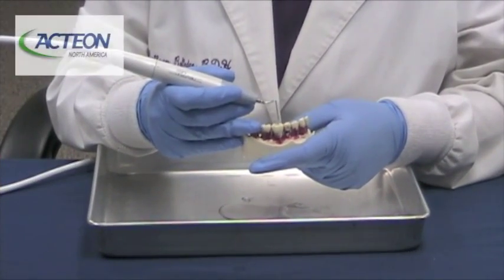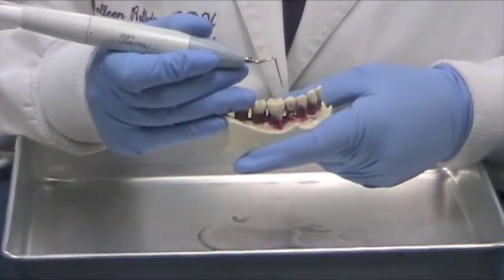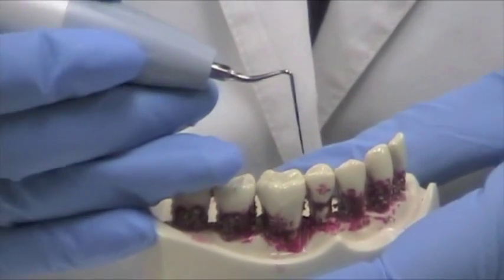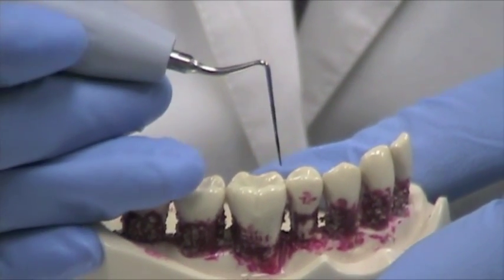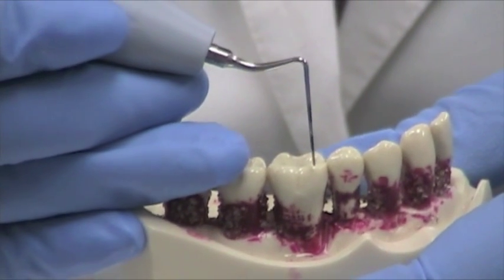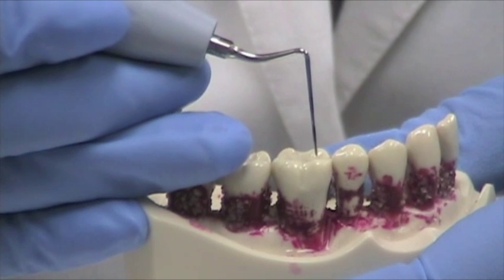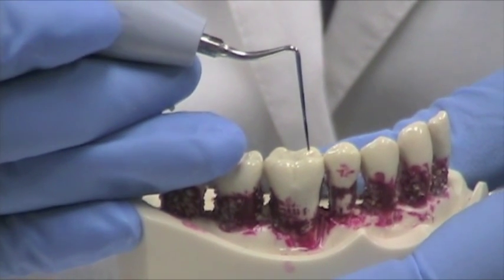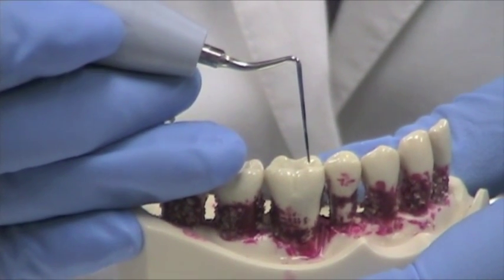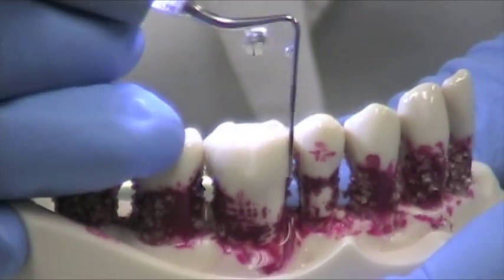Now we're going to demonstrate the TK-1-1L. Again, you can see this — it's not a probe, but it looks just like a probe. This insert is for periodontal pockets that are deeper, going to 5, 6, 7mm. You can see the calibrations are marked exactly like the short perioprobe — it's 3, 6, 9, and 12. Same indications as for our other tip.